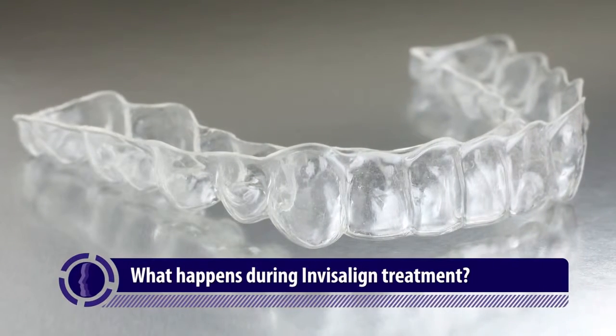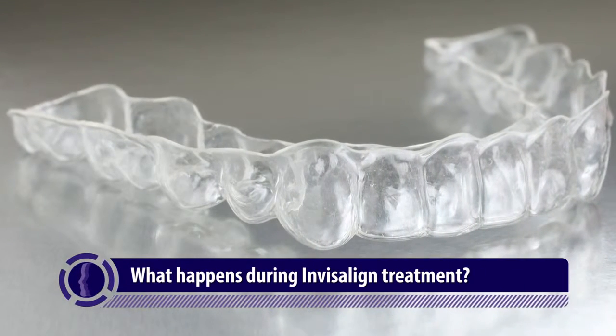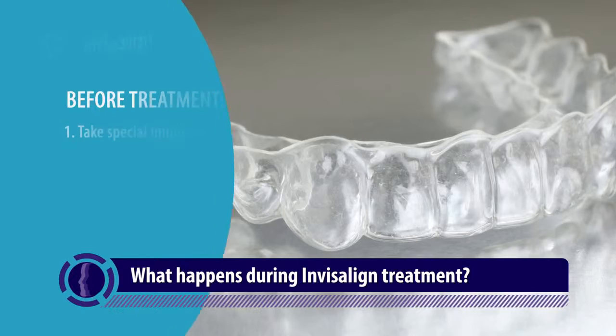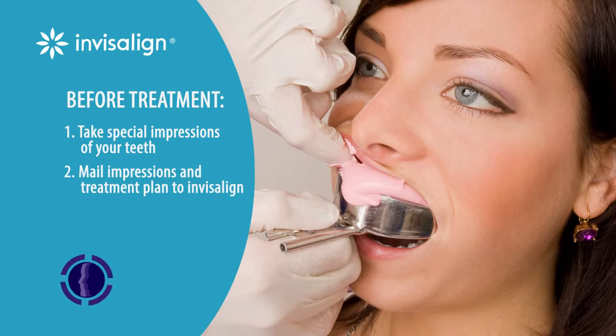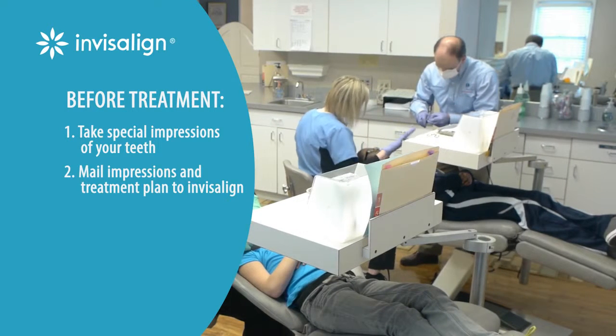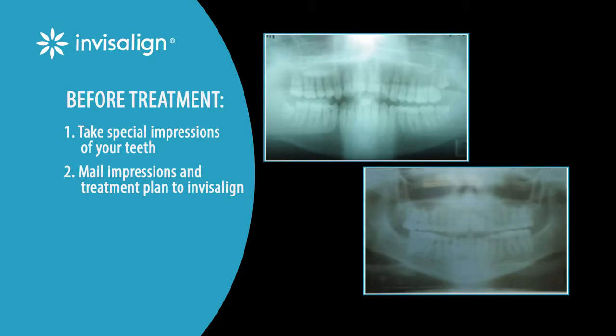So if you come in and we determine you are a candidate for Invisalign, what we do is take special impressions of your teeth. We mail those impressions to Invisalign, and based on the treatment plan that I came up with from you, from our clinical exam, and from the photos and x-rays, I will sit down and type up a detailed treatment plan of exactly how I want your teeth to move.